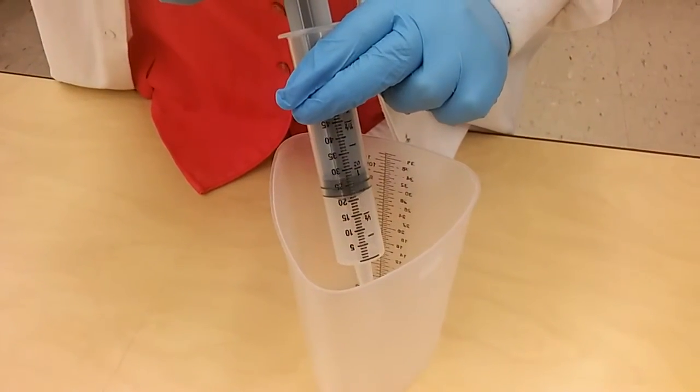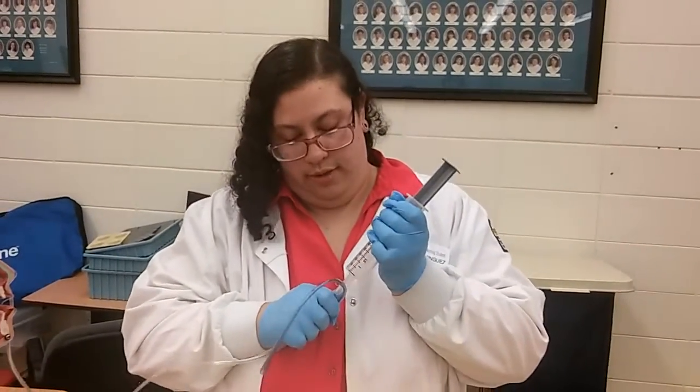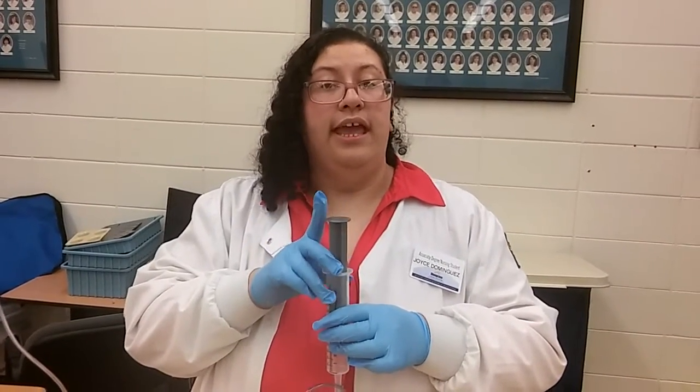Normally it would be normal saline that we would be using. Then we're going to attach to our NG tube, unclamp the NG tube, and holding upright with the tip to the floor, we're going to instill slowly and evenly.